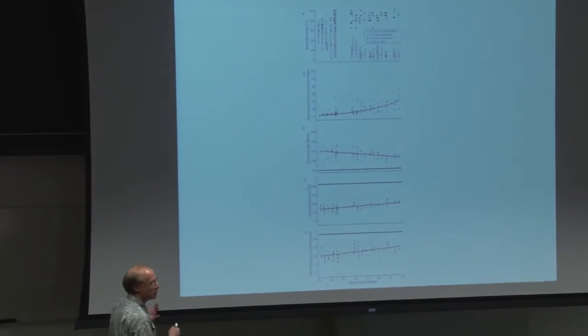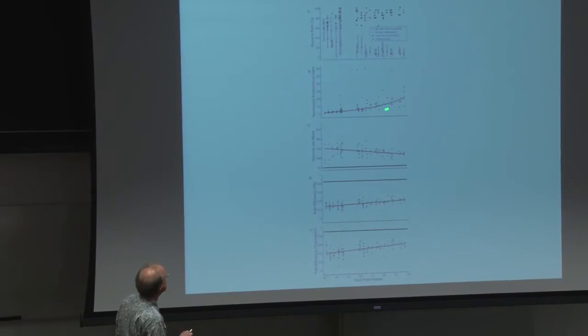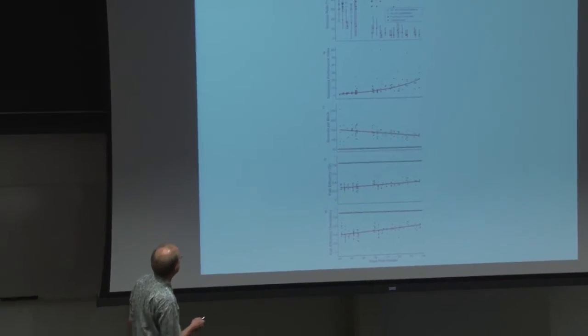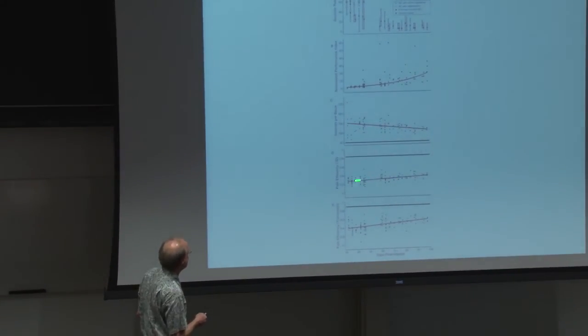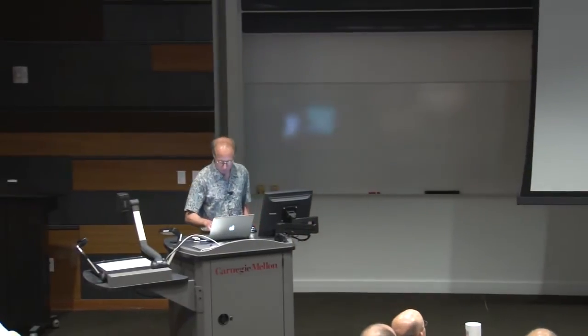So what we have here is a performance index, how successful was she relative to random. And you can see that she has a nice learning curve as she goes up. If you look at the seconds it takes to do this, it goes down in a steady way. If you look at the straightness of the path, the efficiency goes up. And then you can also look at another metric of that path efficiency. So she's doing this consistently every day, and she's getting better as she does it.